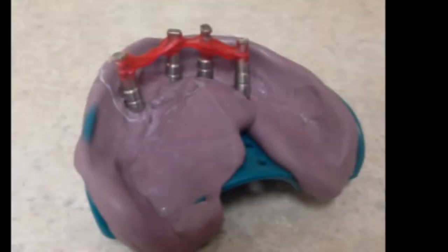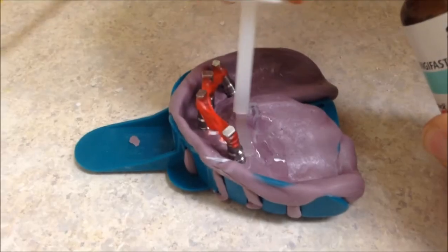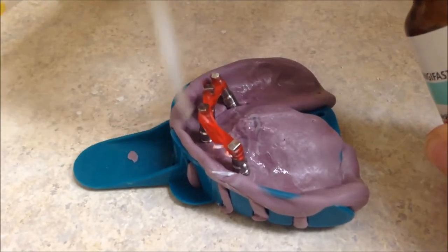The kit comes with a separator that should be applied to the impression and allowed to dry before placing the gingival mask.